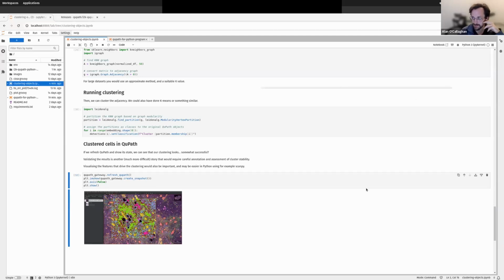I unfortunately made some promises that I don't know if my coding can support, that I would get this implemented in 0.6, but we will see about that.